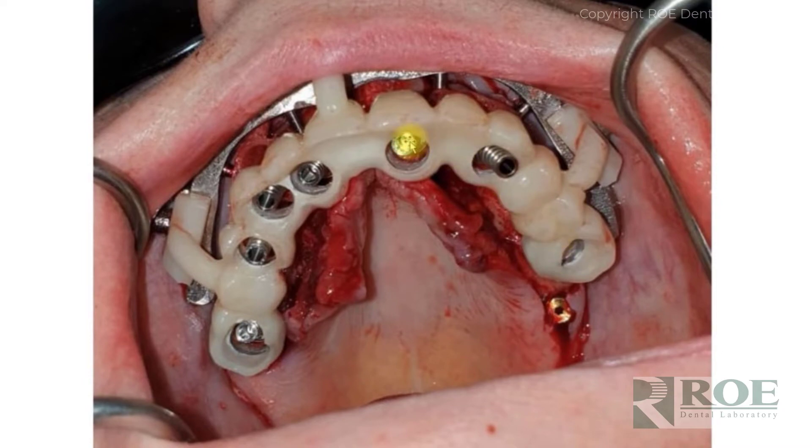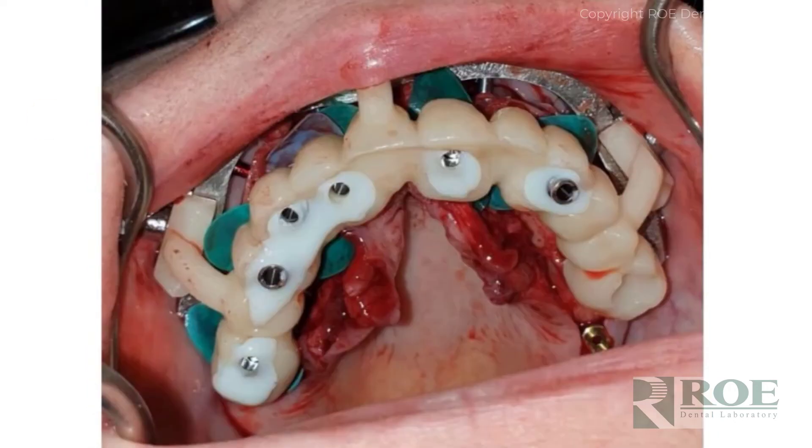By doing this you should not have to adjust the prosthetic very much. There was a little bit of adjustment on the lingual and a couple of others, but very little. The doctor called after surgery and confirmed minimal adjustment was needed. Then you simply backfill all of the implants — you don't need to pick up some now and some after due to trajectory; just seat them all from the occlusal. One implant was left off and will be picked up later.